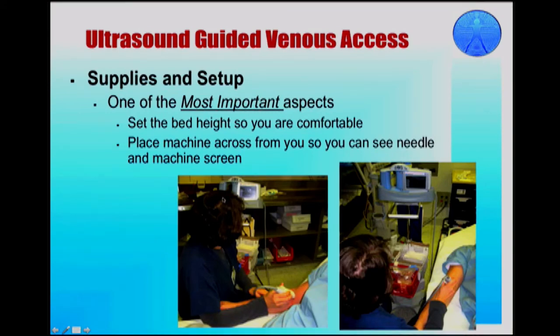If you have to turn your head to the side every time you want to look at the machine, your hand's going to involuntarily move when you turn back towards the machine if it's off to the side. And this causes you to look down at your hand and think you're somewhere, and then when you look at the machine, it's in a different location. So set it so that the machine is right in your line of view. So up at the machine, down at your hand.